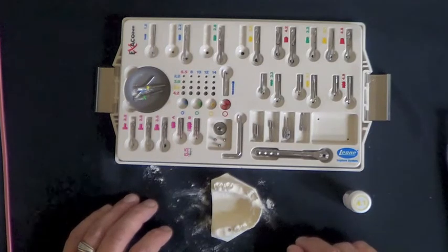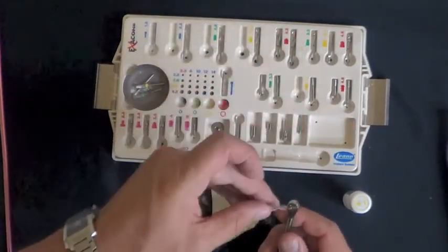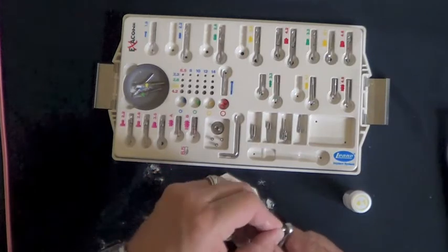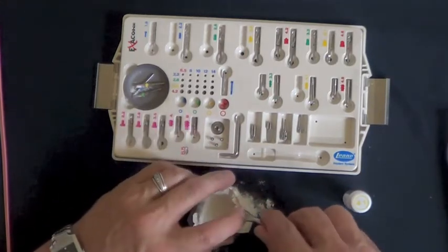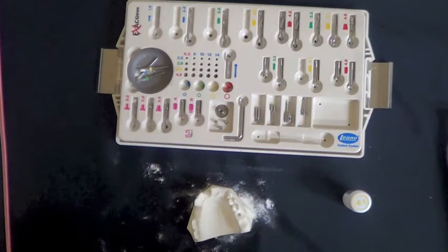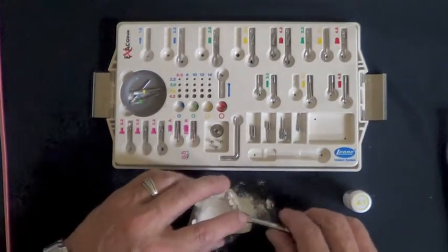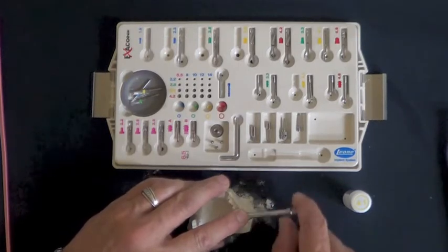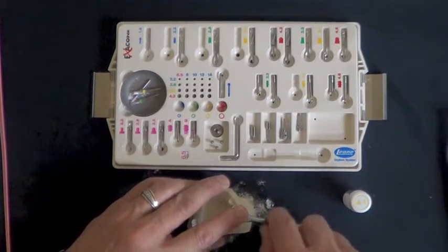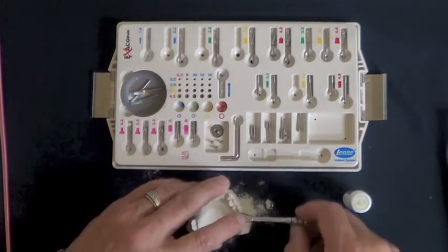Following the osteotomy and the use of the countersink, the next step would be to take the ratchet and the tap and tap the osteotomy site if this was a dense bone profile in that site. So again the tap goes in a clockwise direction, and in this tap scenario would be threading the bone and the tap has to be rotated in and then rotated back out of the osteotomy.